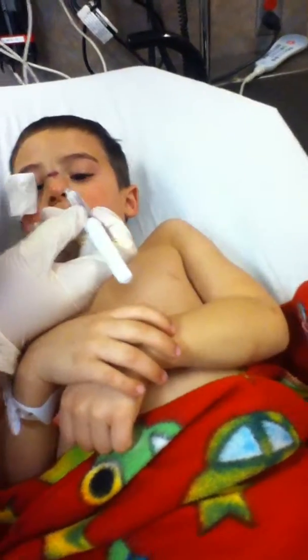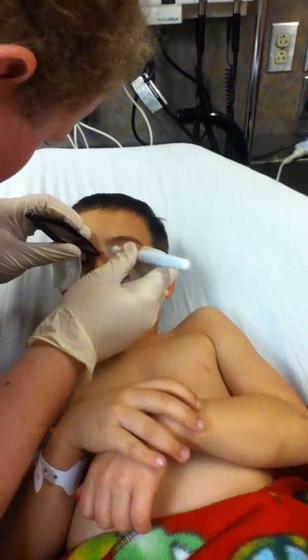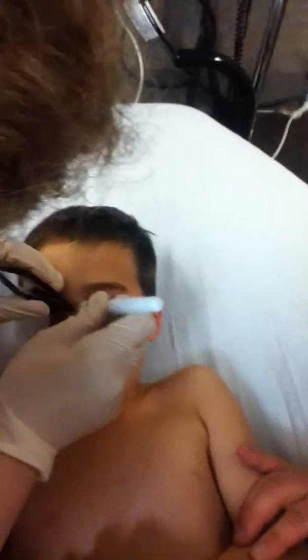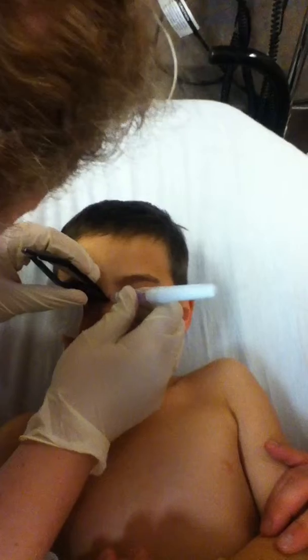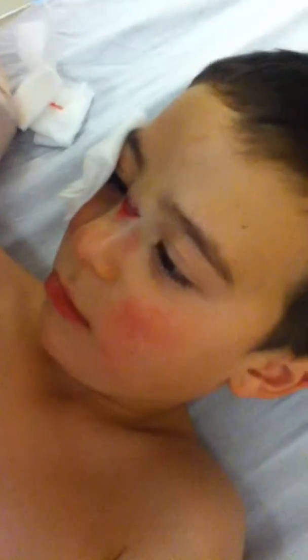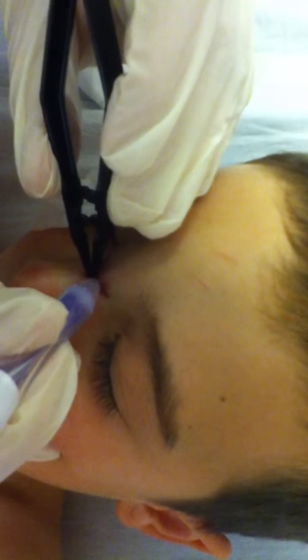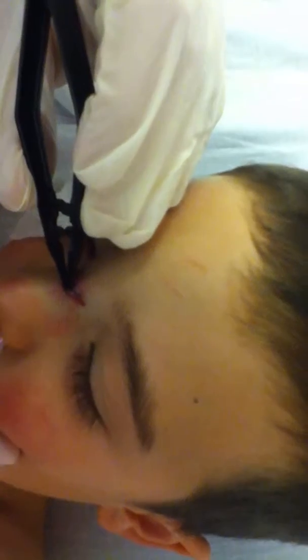See, now it's just gonna — I'm gonna pull that skin right there. Oh, you're doing so good. Hold this hand down for you. Oh, that's cool. You're doing so good. Oh, it dries real fast. That is. And this one's not even working. Here we go. Oh, that's pretty cool.